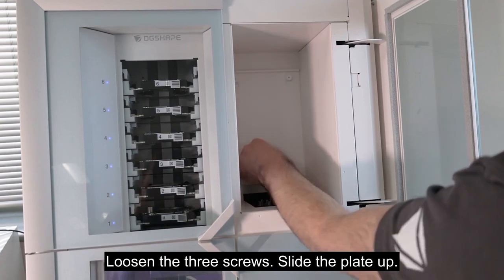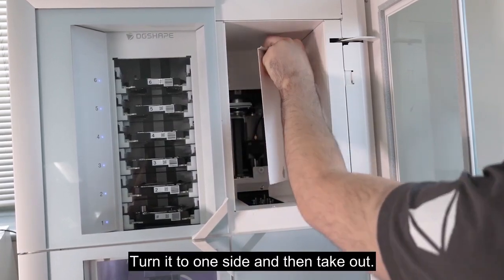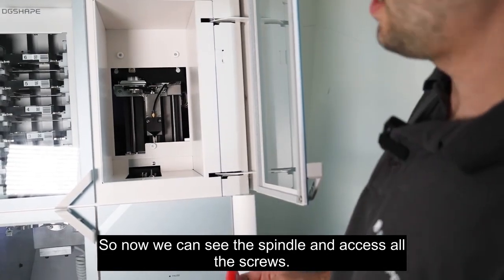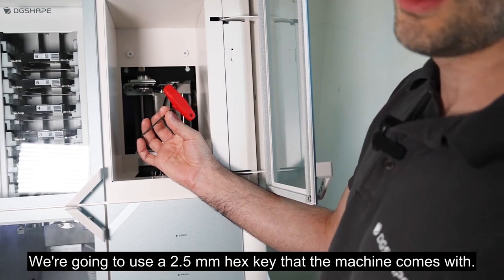Loosen the 3 screws, slide the plate up, turn it to one side, and then take out. So now we can see the spindle and access all the screws. We're going to use our 2.5mm hex key that the machine comes with.